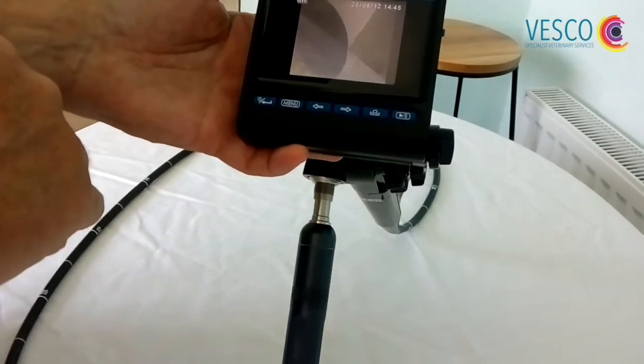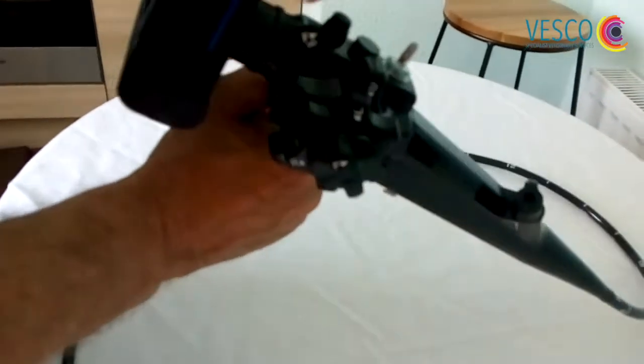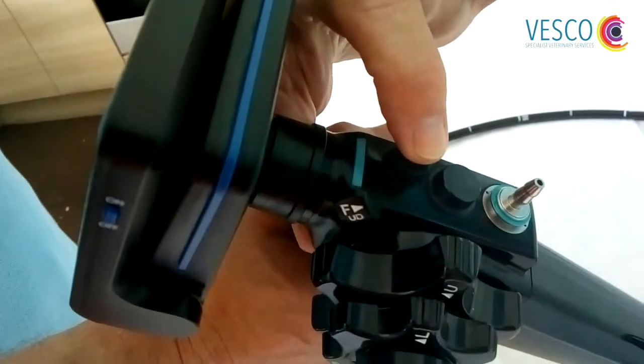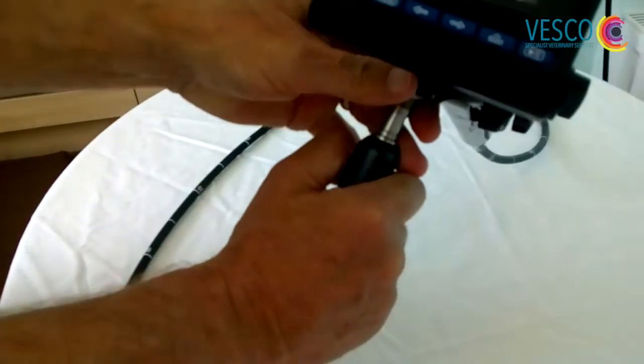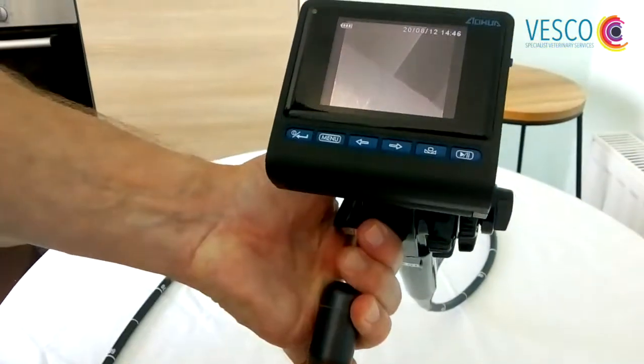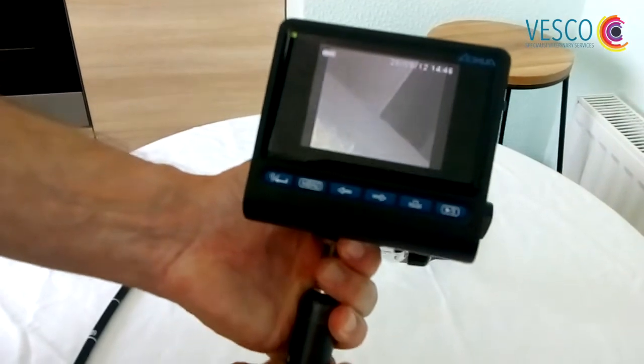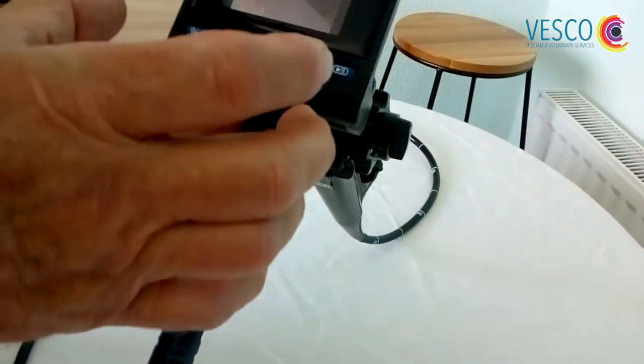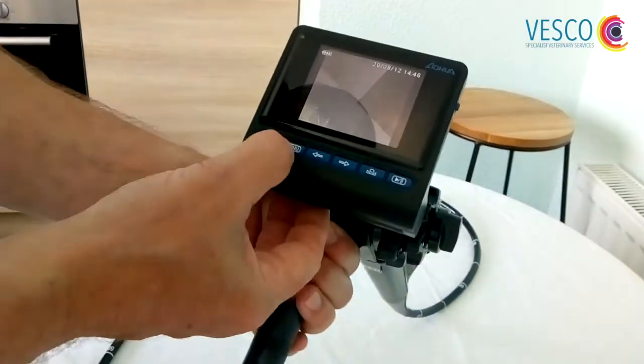To take a photograph, we press this little button at the back here. You simply press it once. What you'll see hopefully is a very quick flash of a camera up in this area here. That now means that that photograph has been delivered to the SD card.